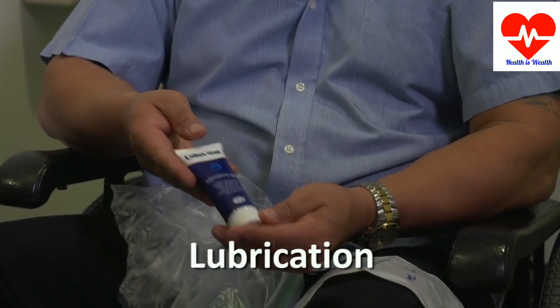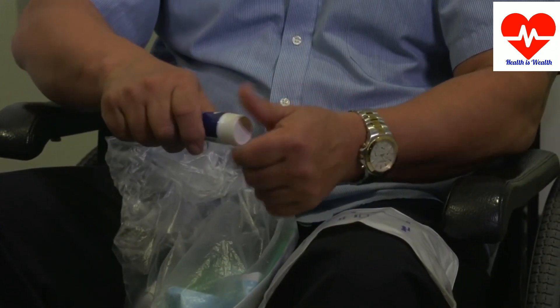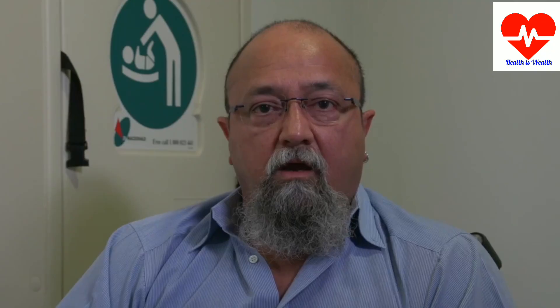You must ensure you have lubrication. This makes sure the catheter can pass smoothly through the urethra. You can have individual packets or a pump pack. If you find it painful to pass the catheter, you can also get a lubricant with a numbing gel. Ask your nurse about this product.